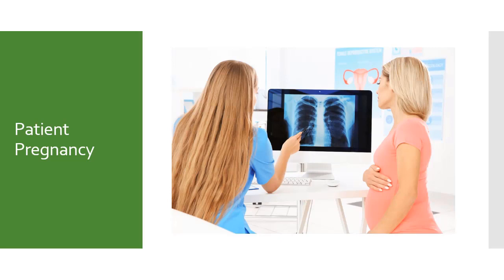Students and the general population are always very concerned about X-ray exams performed on pregnant patients, and they should be. Radiation to the fetus can be dangerous. The radiology department should provide educational materials in the form of brochures, videotapes, and other information in the waiting areas that address these concerns. As a technologist, you should always ask females of childbearing age if they could be pregnant and the first day of their last menstrual period.